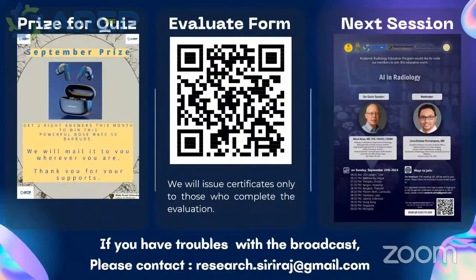I have to add something regarding the last Q&A question. I'm sorry if I was not clear in the protocol. So either you get dynamic contrast enhanced MRI, or if we are not able to get dynamic, then in the non-dynamic protocol, it is a single post-contrast image at 30 to 40 seconds. So we don't have to get both for the same patient. Okay, thank you so much for clarifying that. I hope that helps.